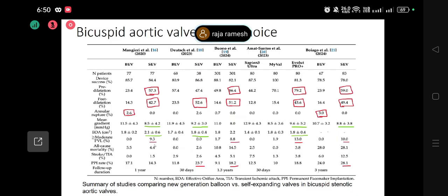But at the same time, the paravalvular leak will be more with self-expandable valves, because the radial strength is initially less when compared with the balloon expandable valve. So there can be leakage around the valve frame, and the paravalvular leak can be more. As expected, the pacemaker risk is more with self-expandable valves because these are tall frame valves, and the nitinol of the self-expandable valve has a property of expanding even after deployment, and this may impinge on the conducting system, causing the need for a pacemaker.